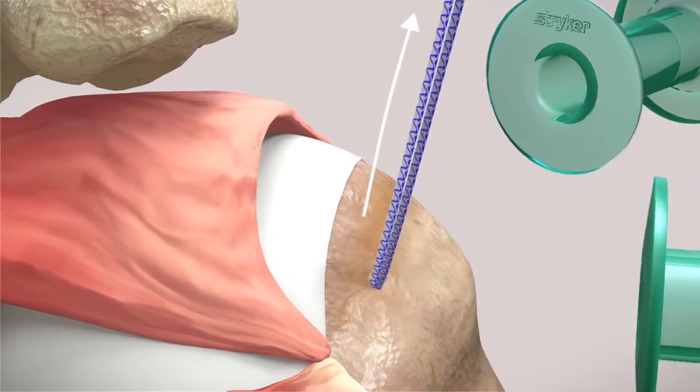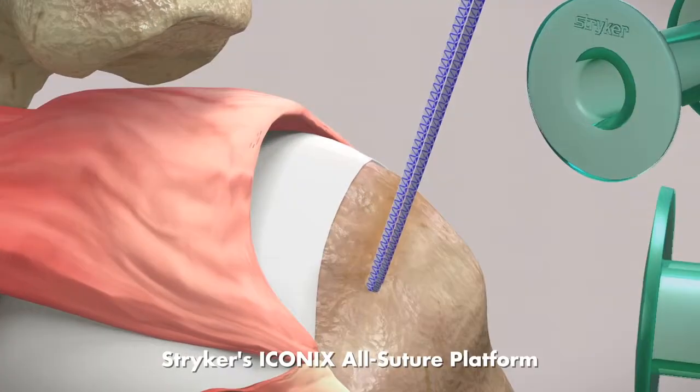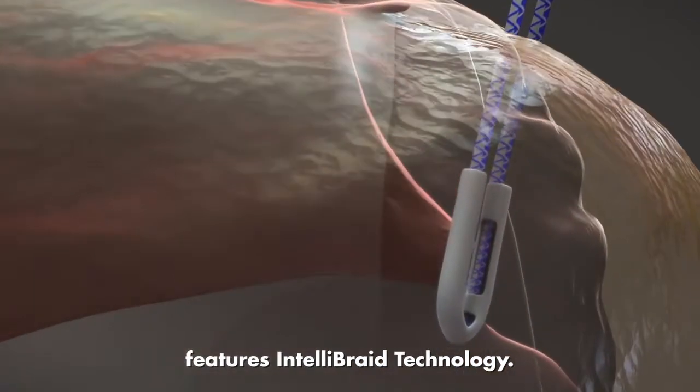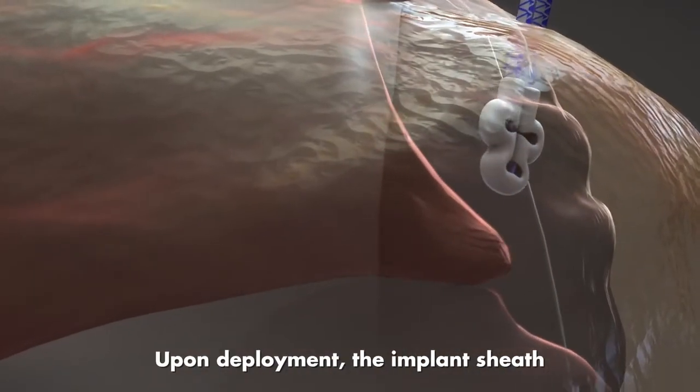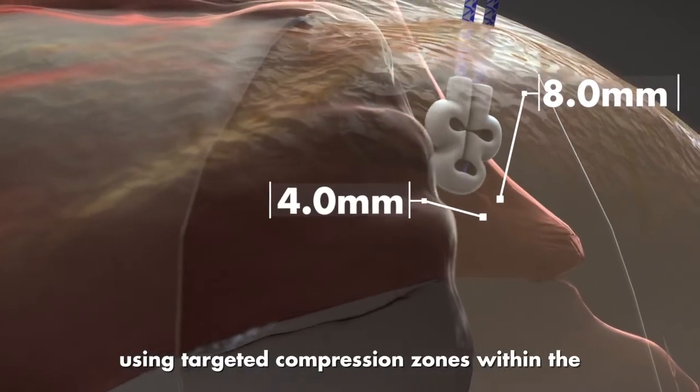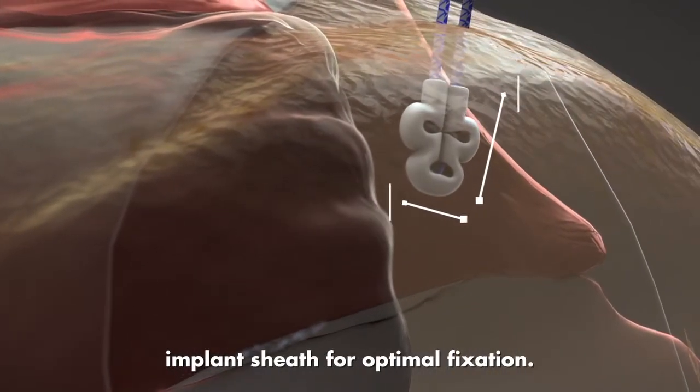Stryker's ICONICS all-suture platform features IntelliBRAID technology. Upon deployment, the implant sheath creates a bunching effect, using targeted compression zones within the implant sheath for optimal fixation.